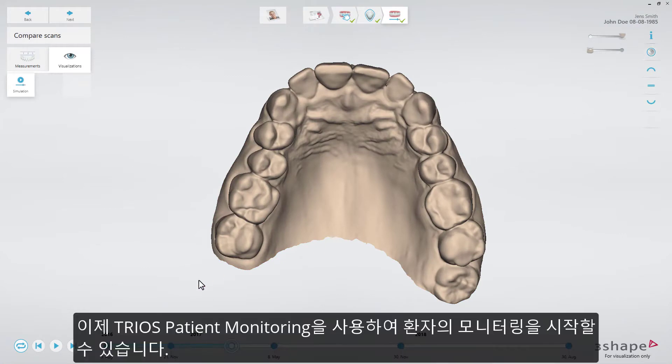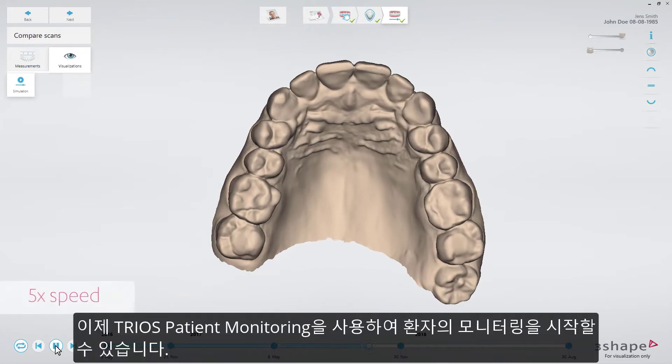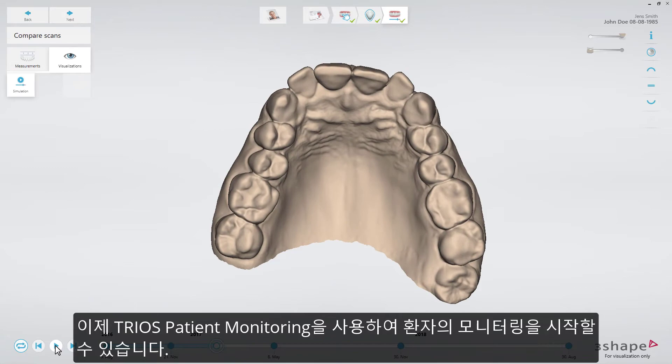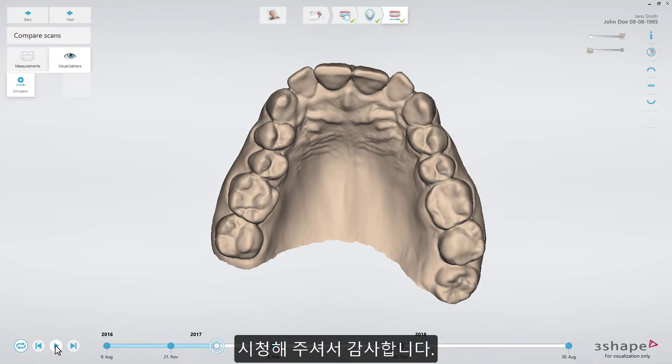Now you can get started with monitoring your patients with TRIOS Patient Monitoring. Thank you.